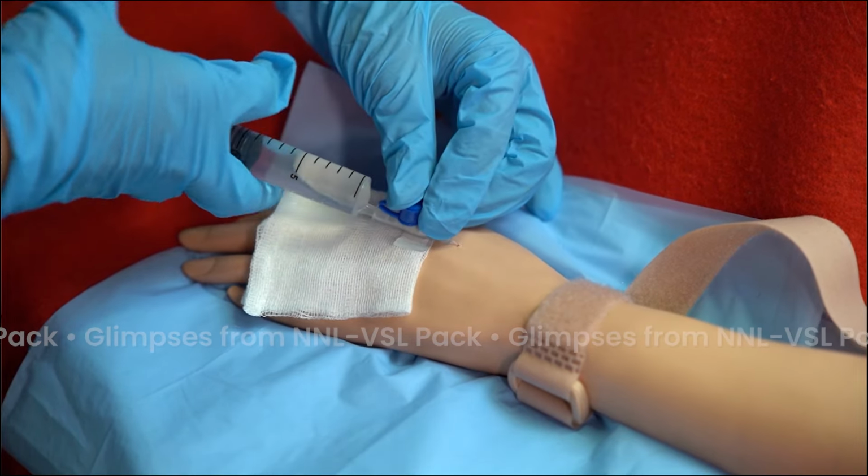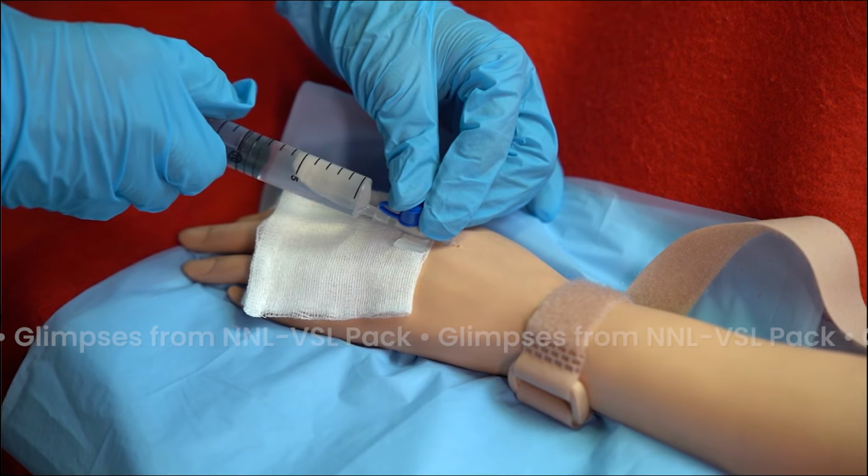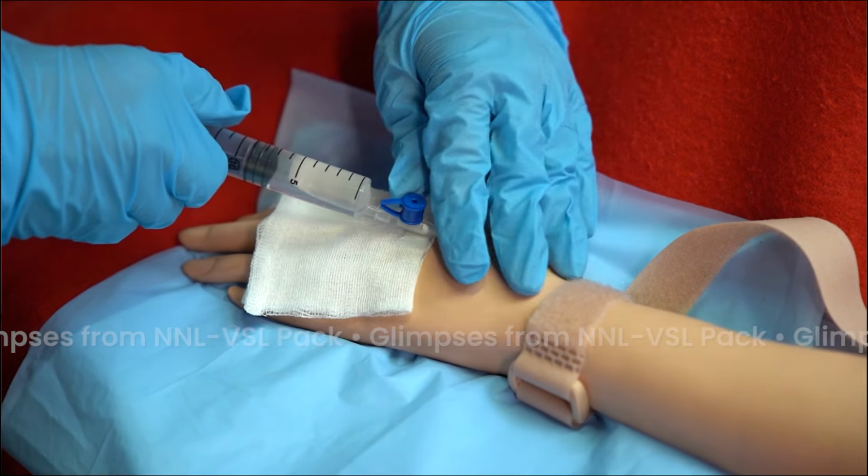Flush the cannula with 2 to 5 ml of 0.9% sodium chloride.